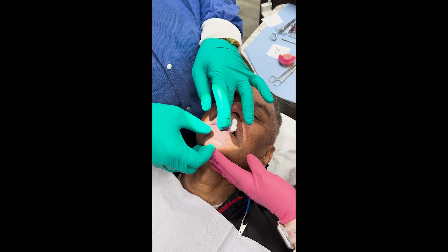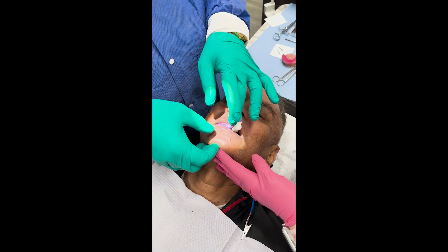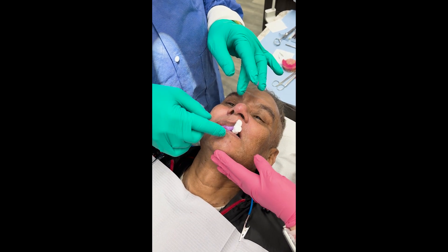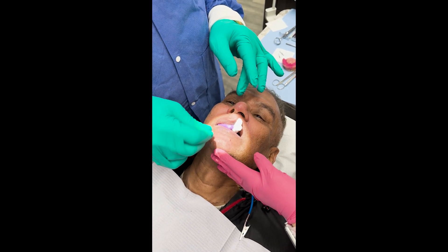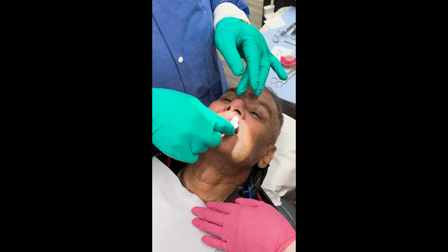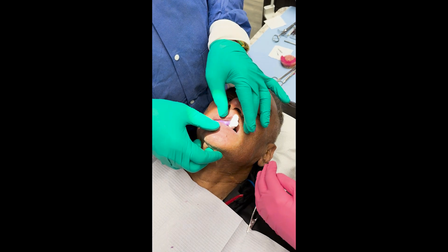When I get this one side, I'll take the cotton out and do the other side. I'm going to confirm this with a measurement to figure out how much to open the vertical.